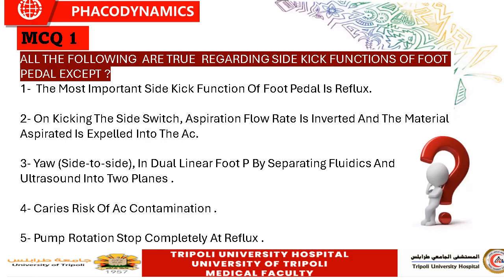So if we want to answer this MCQ, all are true except, so we are looking for the wrong answer. The number one, the most important side kick function of the foot pedal is reflux, which is true. On kicking the side switch, the aspiration flow rate is inverted and the material aspirated is expelled into the anterior chamber. This is true. Yaw, the side-to-side function. Yaw means the side-to-side function of the dual linear foot pedal in Bausch and Lomb. This function is called yaw, and it is meant to separate the fluidics and the ultrasound into two planes. This is true. By this function, we separate the aspiration, irrigation, and vacuum from the ultrasound.